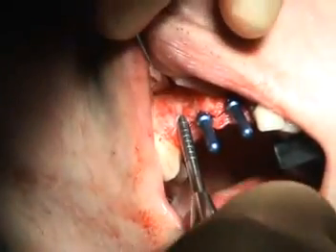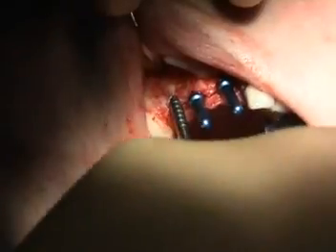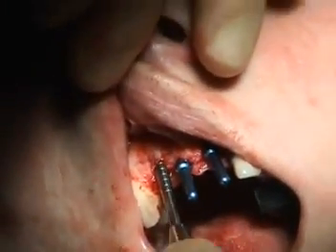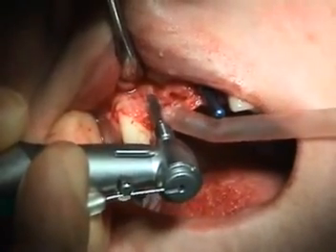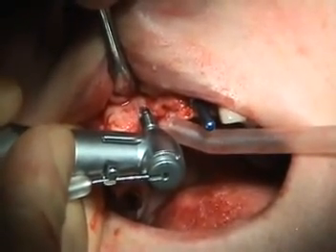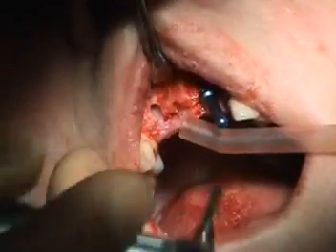A site former is used to produce some expansion of the narrow residual ridge. Final profile burs are now used to prepare the 3.75 diameter osteotomy sites for the Centerpulse MTX implants.